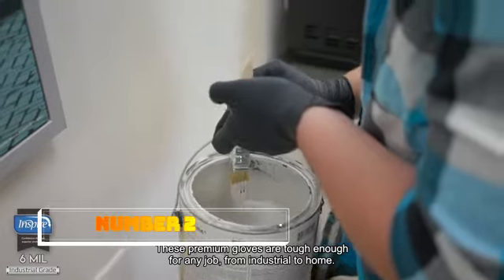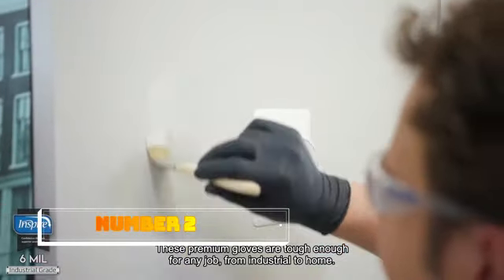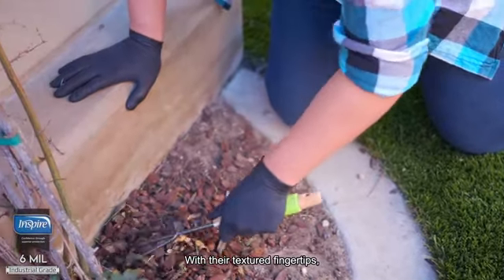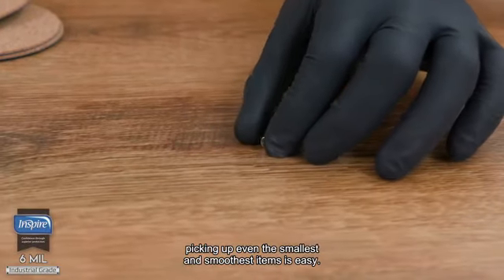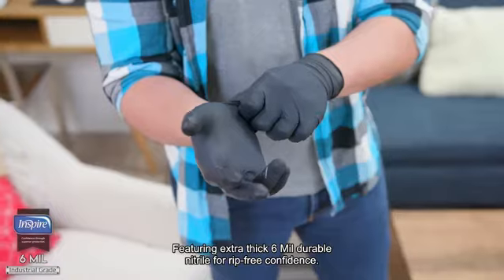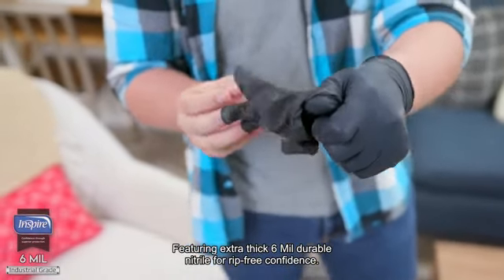The Basic Blue Medical Nitrile Exam Gloves are an essential product for anyone in the medical or healthcare industry. Made from high-quality nitrile, these gloves provide a reliable barrier against contaminants and are suitable for a wide range of medical procedures.